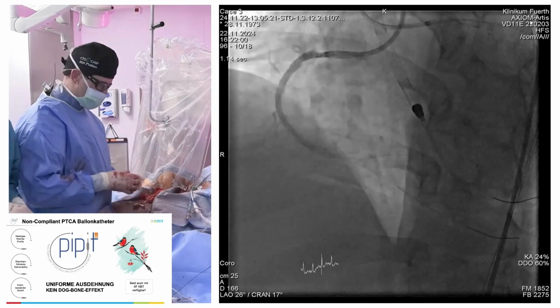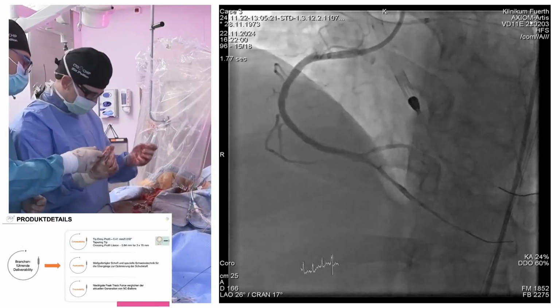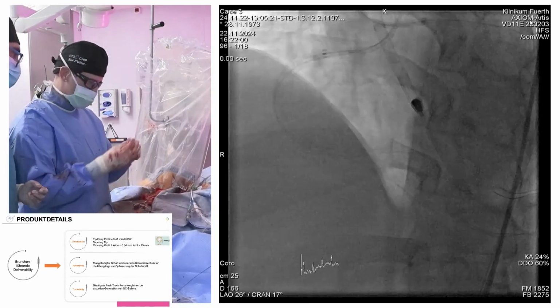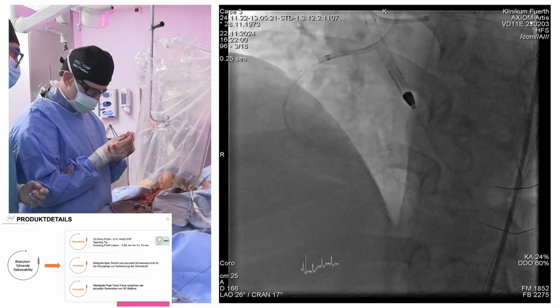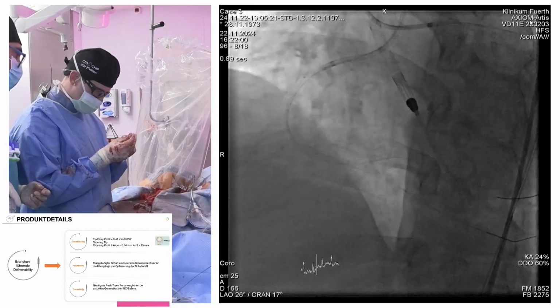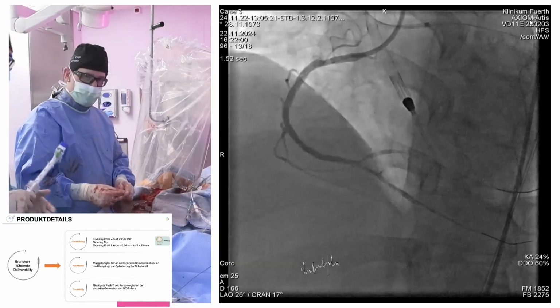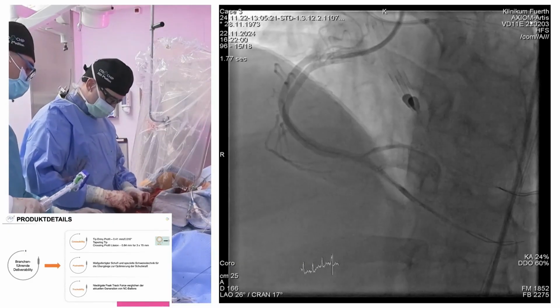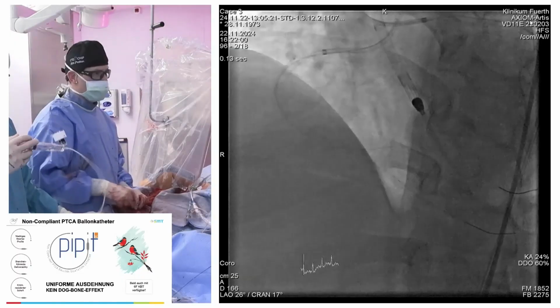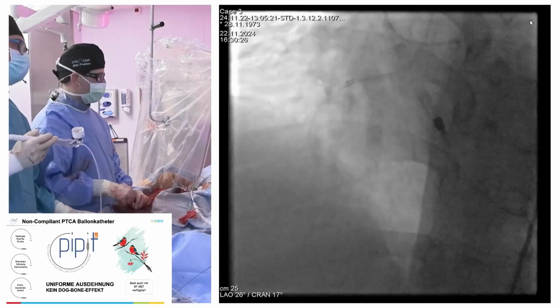Especially in the proximal part, I spent 10 years with balloon angioplasty, and it also came from Germany. There was a big balloon concept: we work with big balloons. Dissection doesn't matter. If you wait a bit, if the vessel is patent, you leave it and it heals, and you need not put in metal. What you see in here, a 2.5 metal stent, is killing the patient. You can't do anything with this afterwards. For this reason, we should always be very careful. We use stents, no question, but we should be careful about using the metal stent.